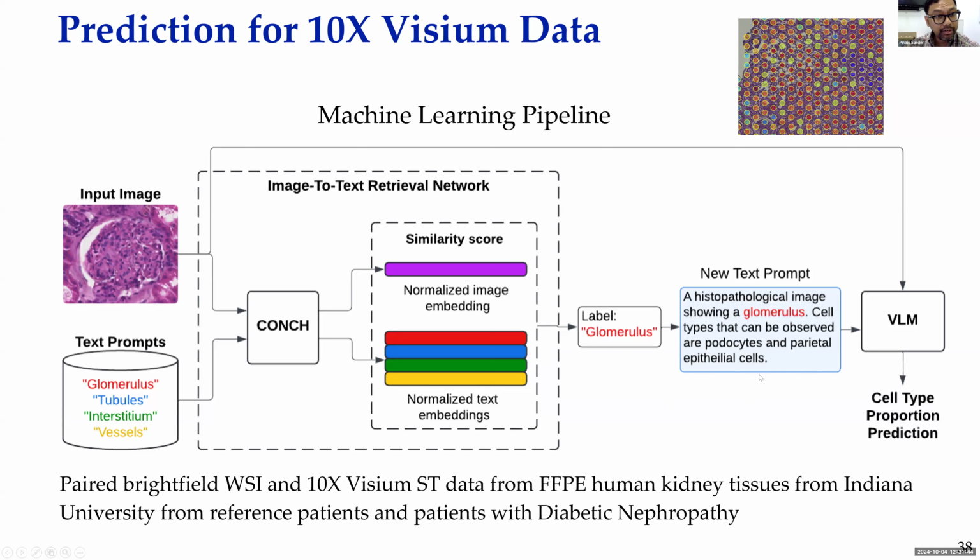Why do I want to do it this way? Because this opens up the possibility to do better engineering. Imagine if I have a cloud tool available and I ask you guys to write text with your understanding. This kind of system can be trained based on human interaction and find rare cell types based on human observation, while I can also bring in spatial information. So that's where he is going with his intuition.